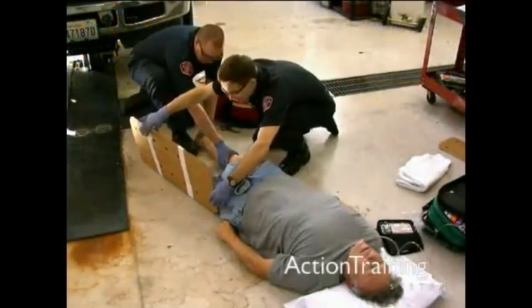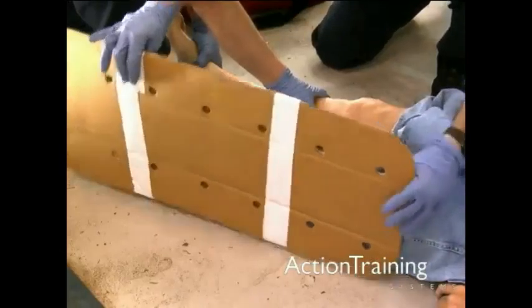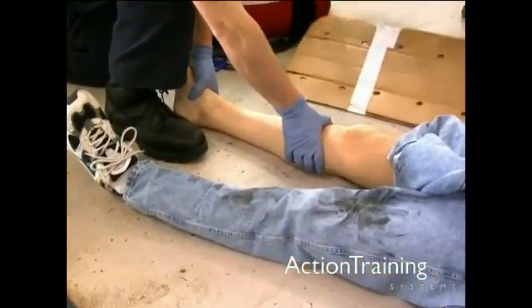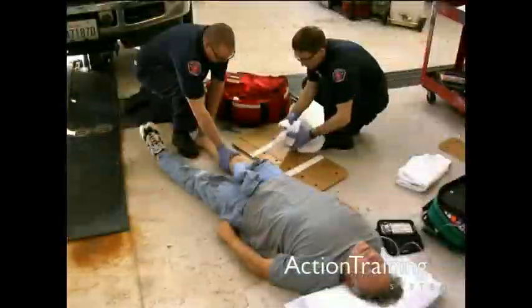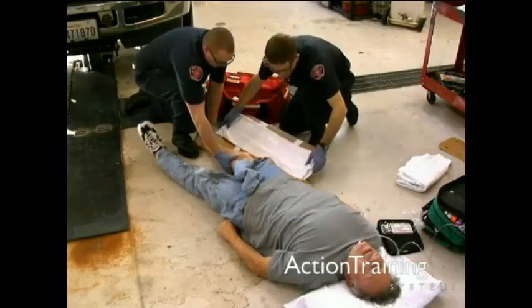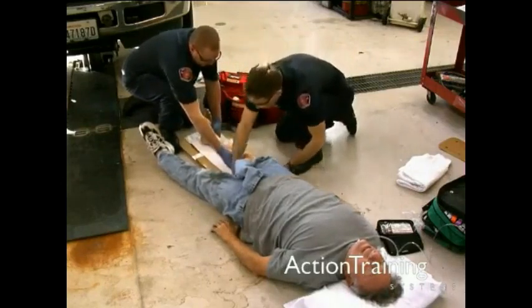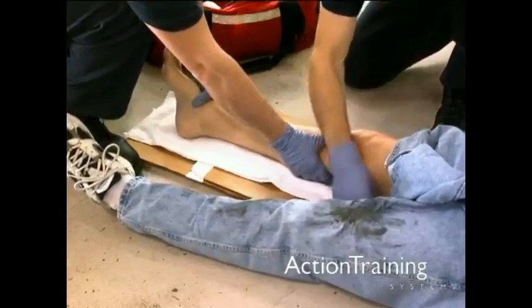Using the uninjured extremity, measure the splint. It should extend several inches beyond the joints above and below the injury. Position the splint alongside the side of the limb where it will be applied. Prior to application, pad along the inside of the splint if needed to prevent discomfort and unnecessary pressure.